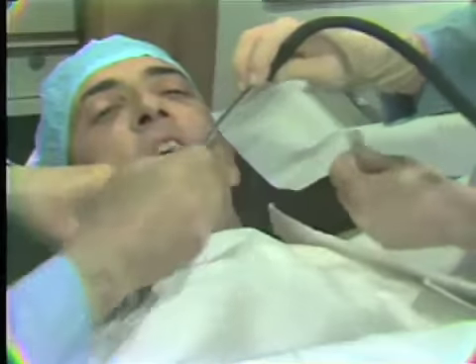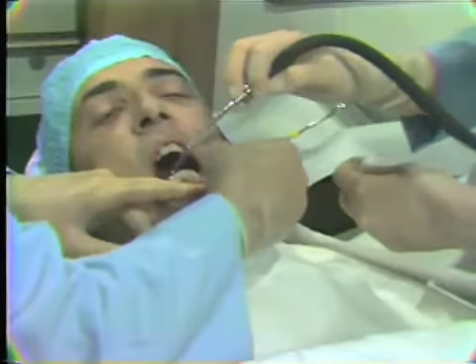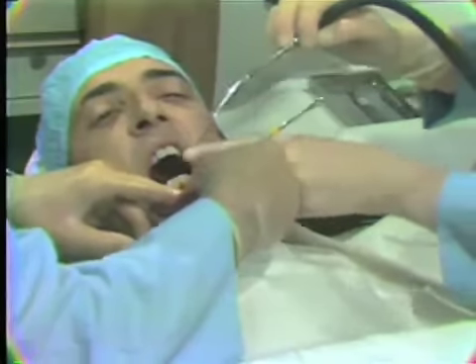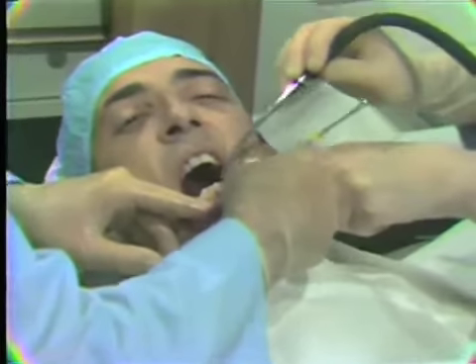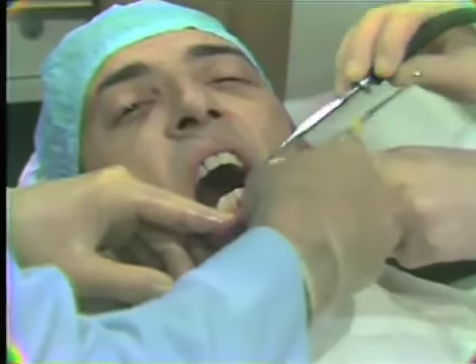You will note that our assistant moves continually back and forth over the area of surgery. Rather than staying in one place, she moves along the whole surgical site. She tries to anticipate where I'll move to, and this is of great help in aspirating ahead of us so that the area that we need to visualize is clearly viewed.